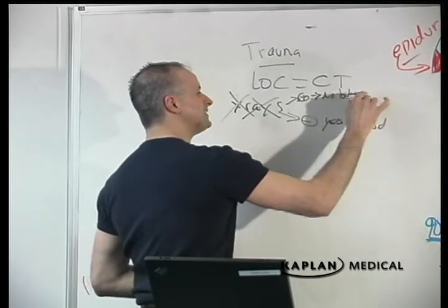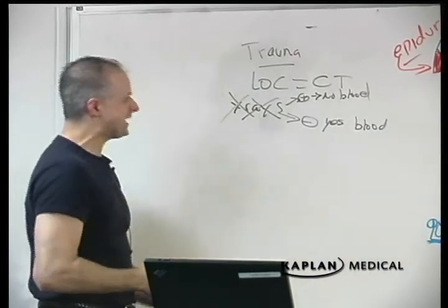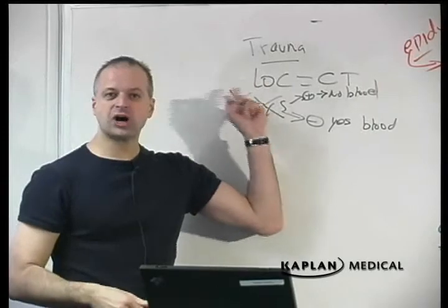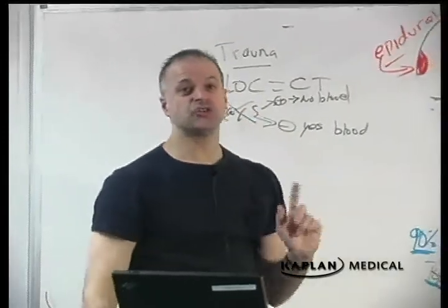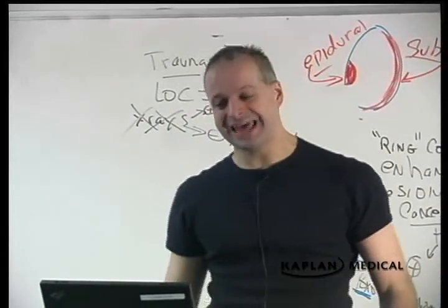So if I'm really looking for blood, I need a CAT scan. Trauma to the head, I'm looking for blood. So therefore, I'm looking with a CAT scan.